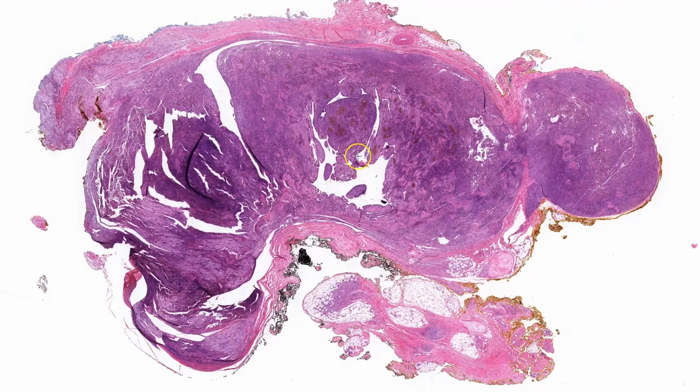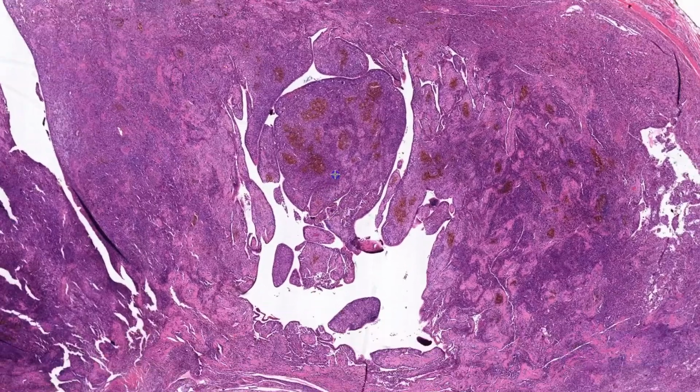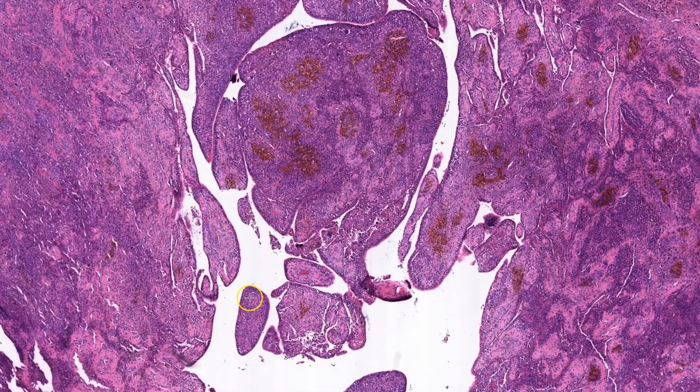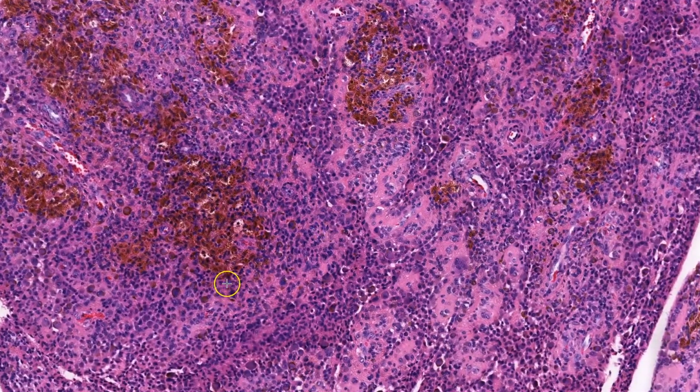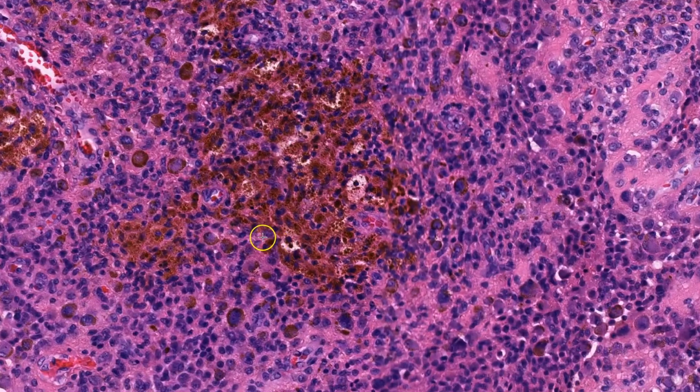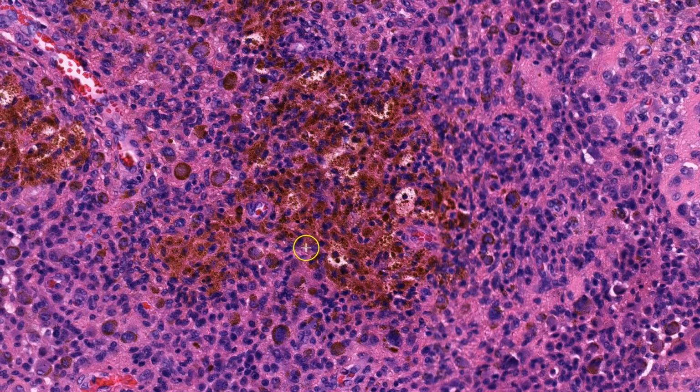In this example, you can see cleft-like spaces forming pseudopapillary type structures. This is another feature that can be seen in tenosynovial giant cell tumor. In addition, there is abundant hemosiderin deposition. Often, the hemosiderin likes to accumulate in mononuclear tumor cells around the periphery. These are referred to as ladybug or ladybird cells.